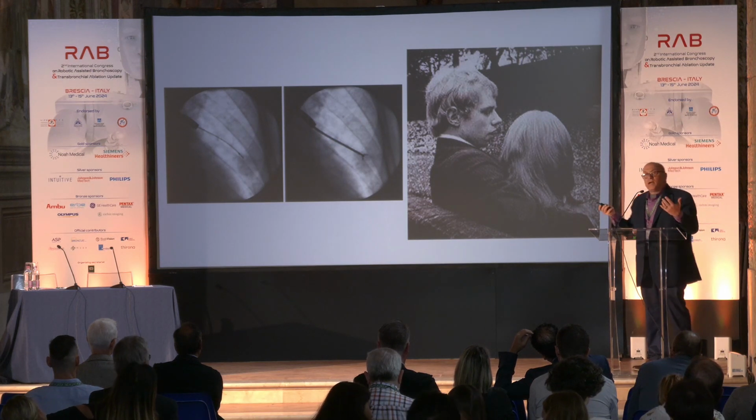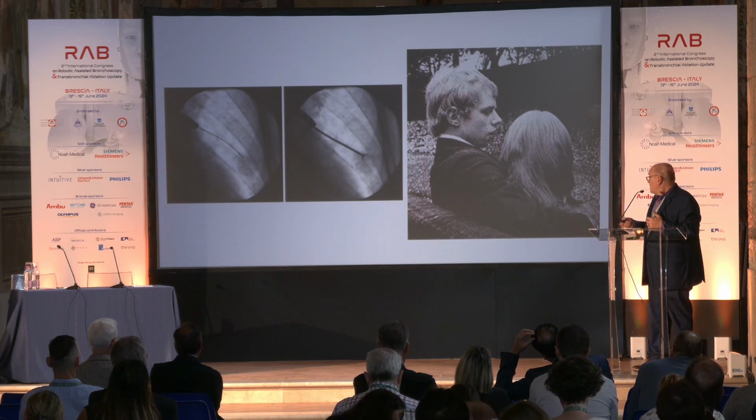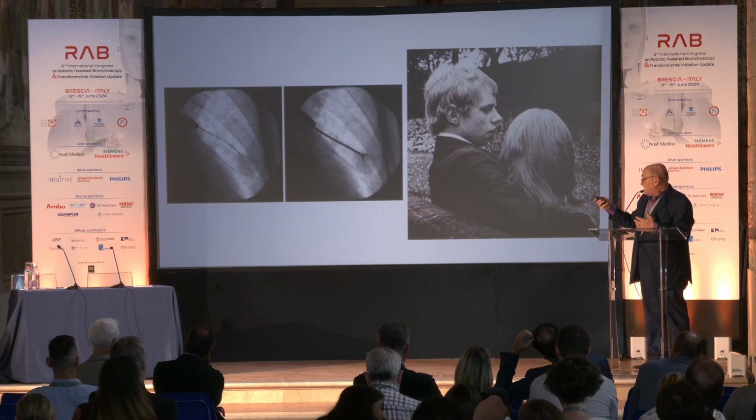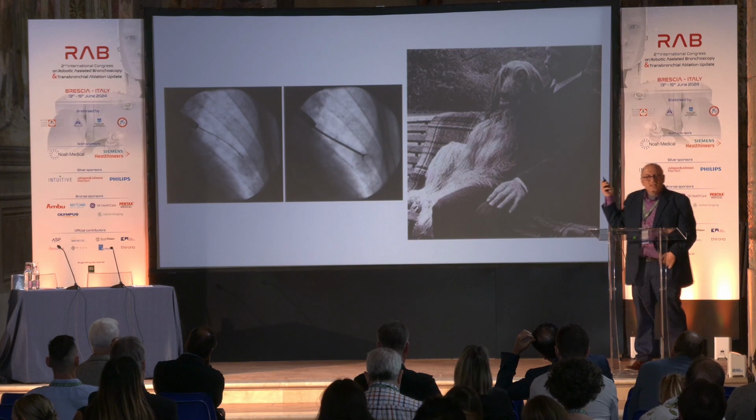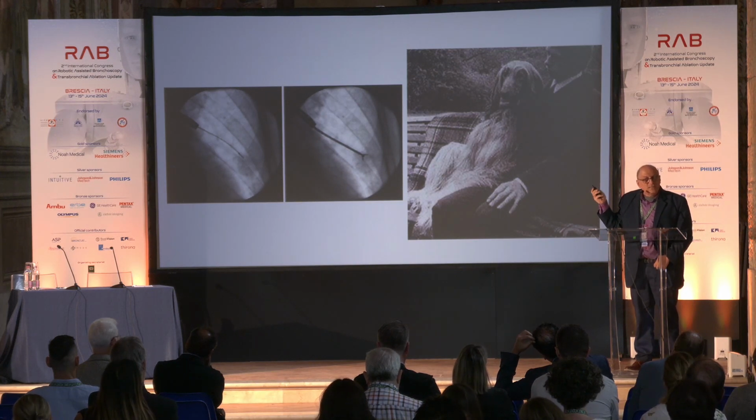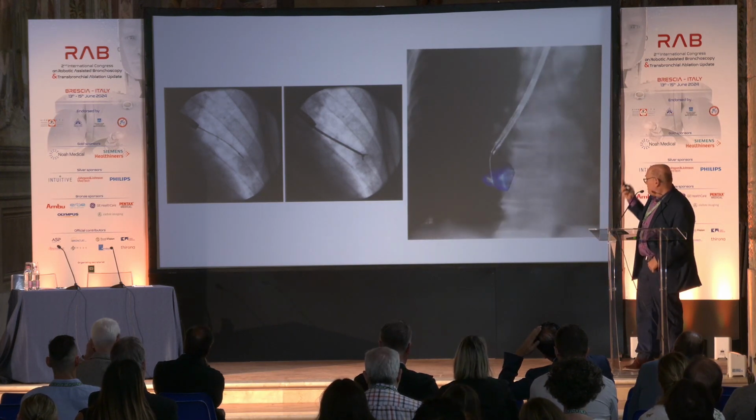Here, if anybody saw the live case yesterday, this is sort of what you see. You think you're in the lesion, but maybe not. And boy, that looks stunningly like Chris Warden, doesn't it? It's not him, but maybe it's related.